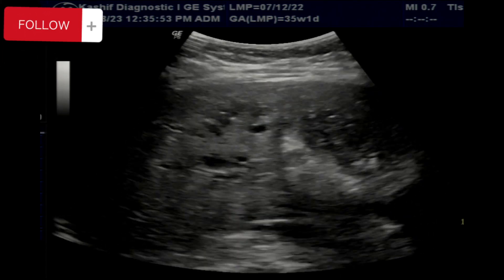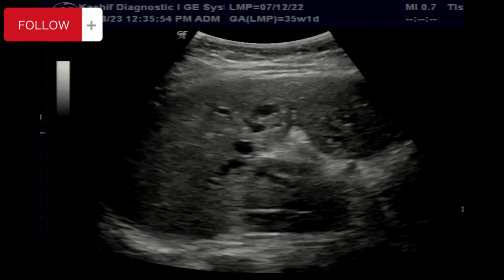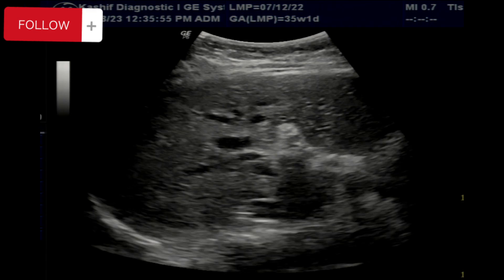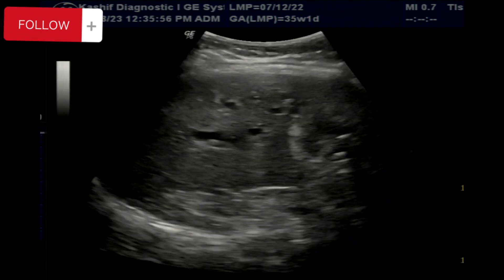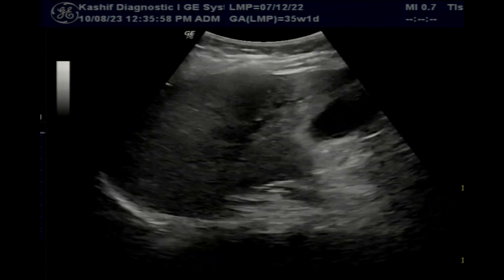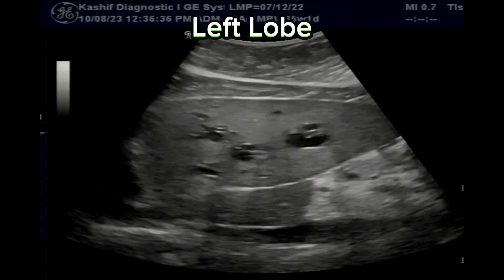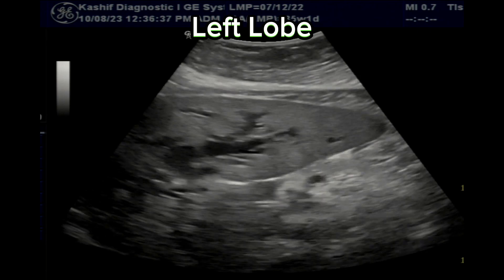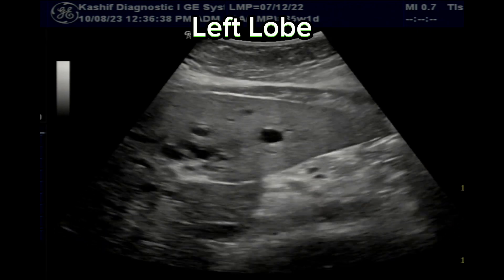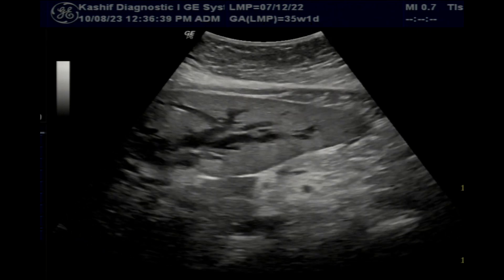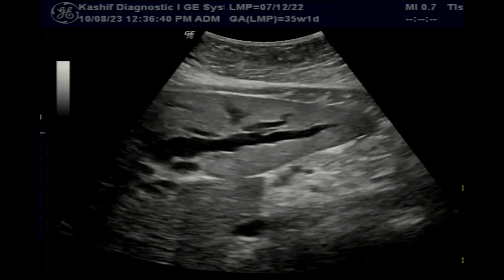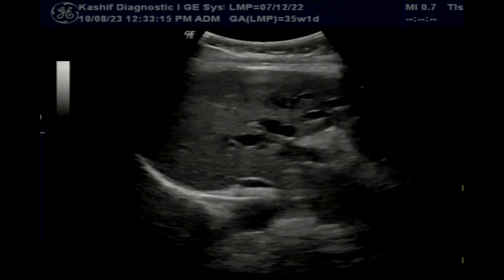These are grossly dilated intrahepatic bile ducts. The left lobe also shows a similar pattern of dilated bile ducts.